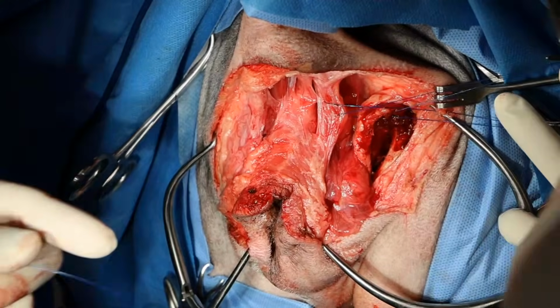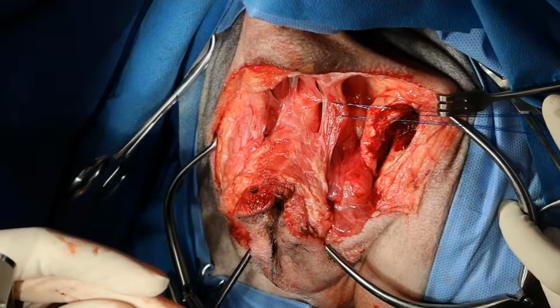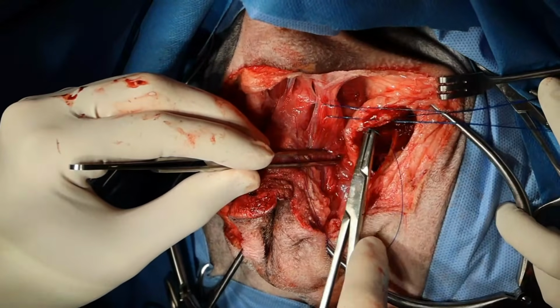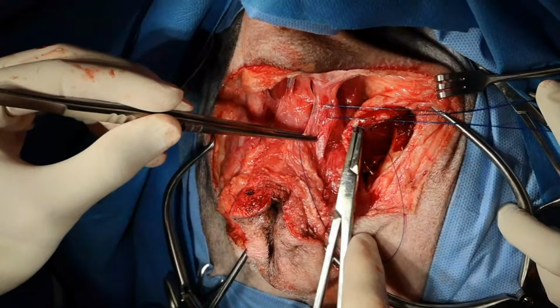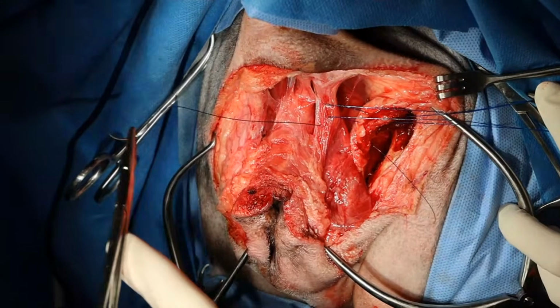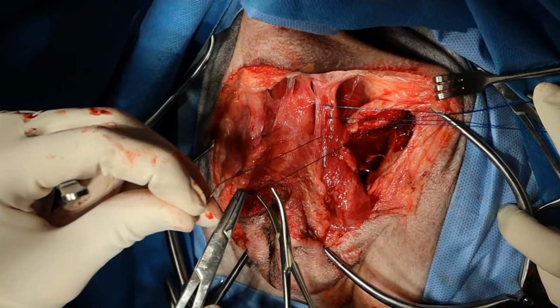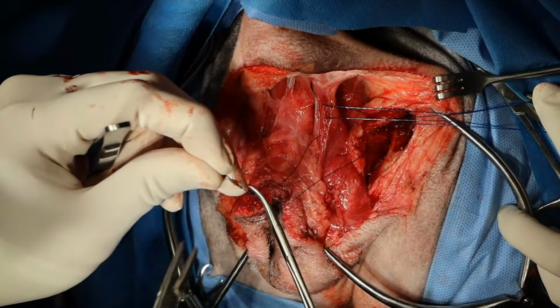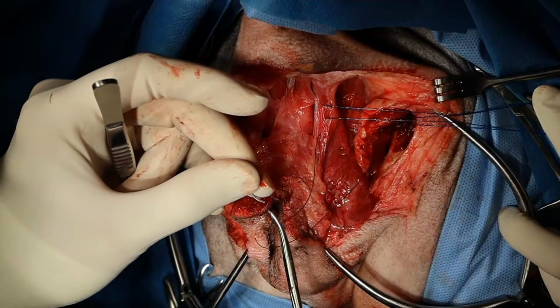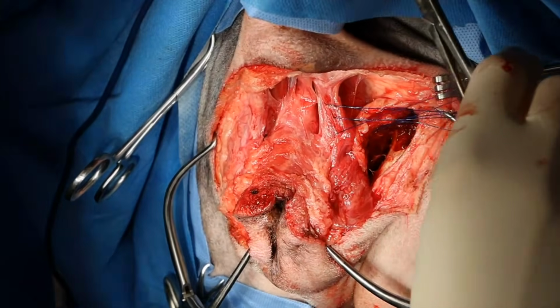Hand that off. Some people mix absorbable and non-absorbable suture when they do these. I don't really see a reason to do that. I would just use all non-absorbable. Some people think that you'll incite more scar tissue by using absorbable, like catgut or something like that, but I'm not a big believer in that. Do we still have catgut? I mean, obstetricians still use it in humans. Oh, to get that reaction. Yeah.